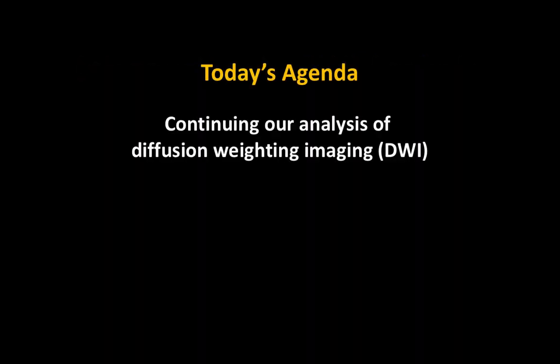Today's agenda is going to be a continuation of our analysis of diffusion-weighted imaging, but it's going to be giving you another option for how you want to analyze diffusion-weighted imaging data. So before we talked about DTI analysis, and today we're going to be talking about a new package called MRtrix. And in my opinion, I think it overcomes some of the disadvantages that DTI analysis has. It has some very good properties. It's a new way to look at your data. And for the people who do have diffusion-weighted data, I recommend it as another perspective.